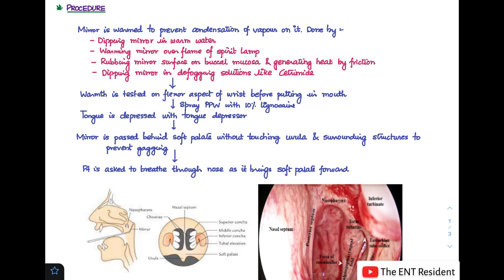First, you have to make sure that the mirror is warmed so as to prevent condensation of vapor on it. There are many ways to do this: the most common is to dip the mirror in warm water, or you can warm it over the flame of a spirit lamp, or rub the mirror surface on the buccal mucosa to generate heat by friction, or use defogging solutions like cetrimide.